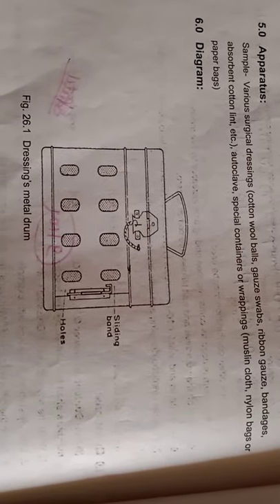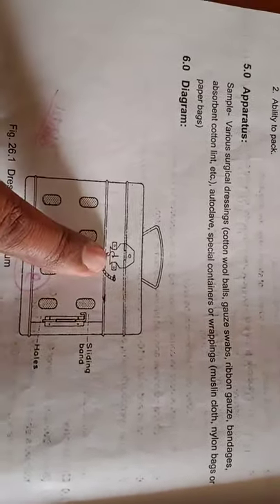Here you can see a metal dressing drum, which has a sliding band and holes are given. This is the locking system for this dressing metal drum.